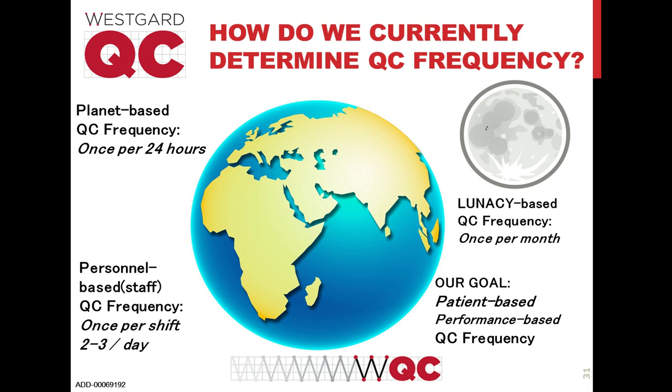And in the last 4 years, we adopted in the US something called IQCP, which justifies an even stranger practice, which is to reduce your QC to once a month. You're basing your QC frequency on the lunar calendar. None of this seems to be related at all to the patient. The patient's health state doesn't have to have anything to do with the phase of the moon, nor does it have anything to do with how fast our planet is turning.